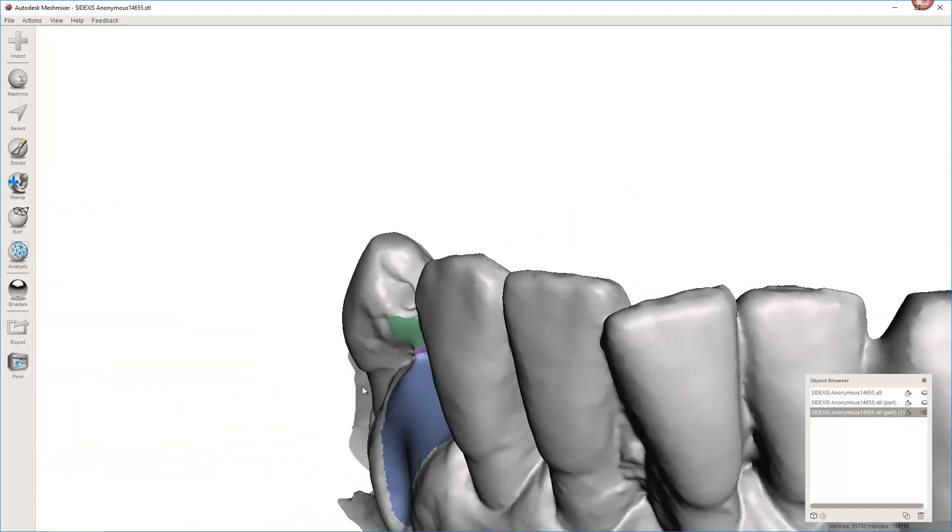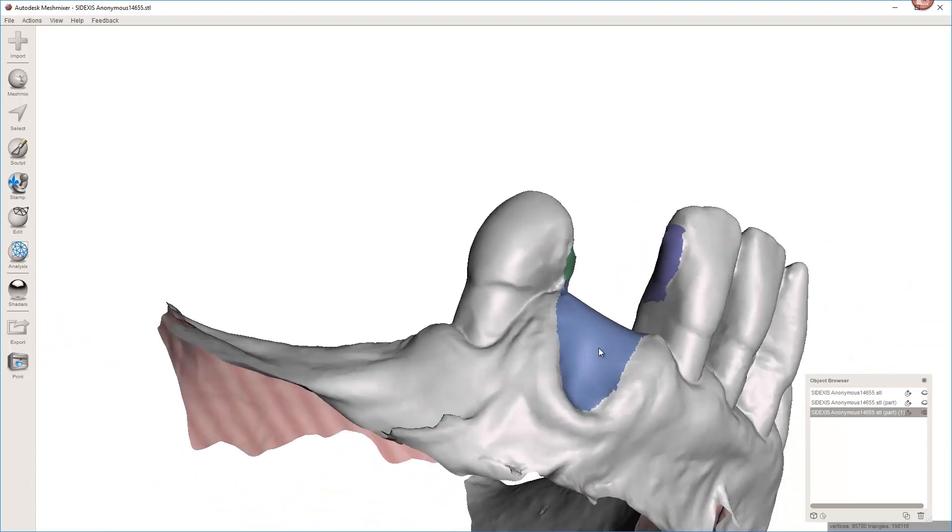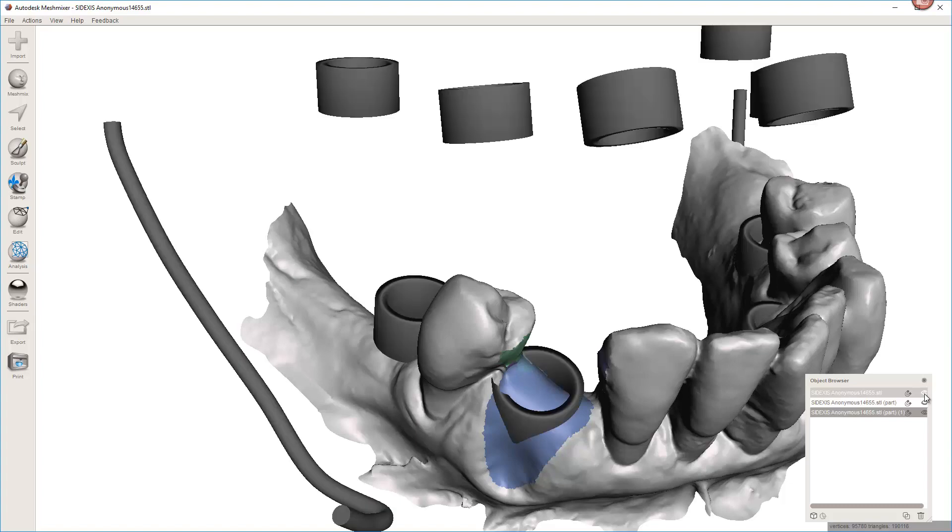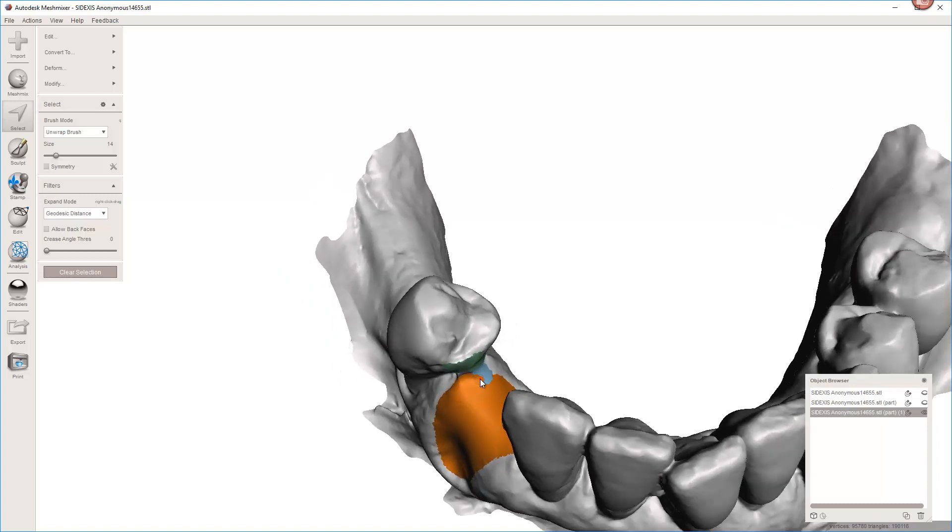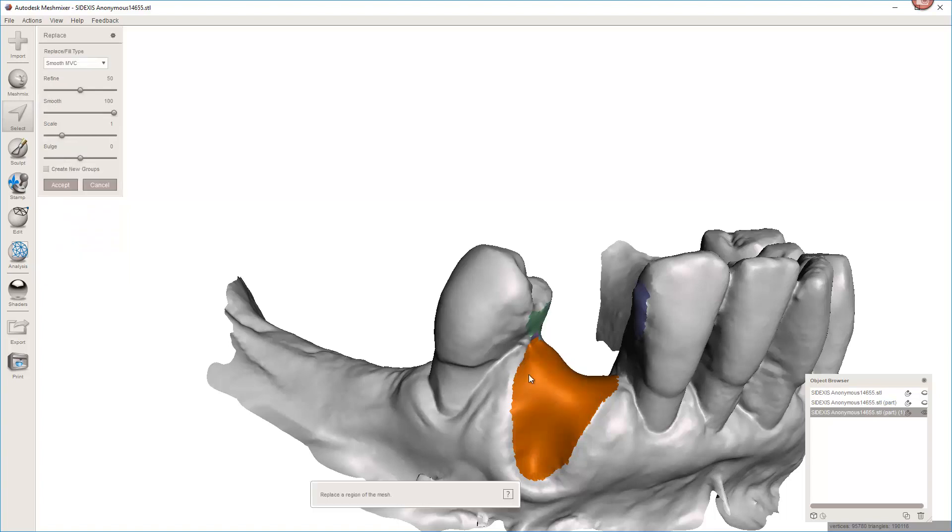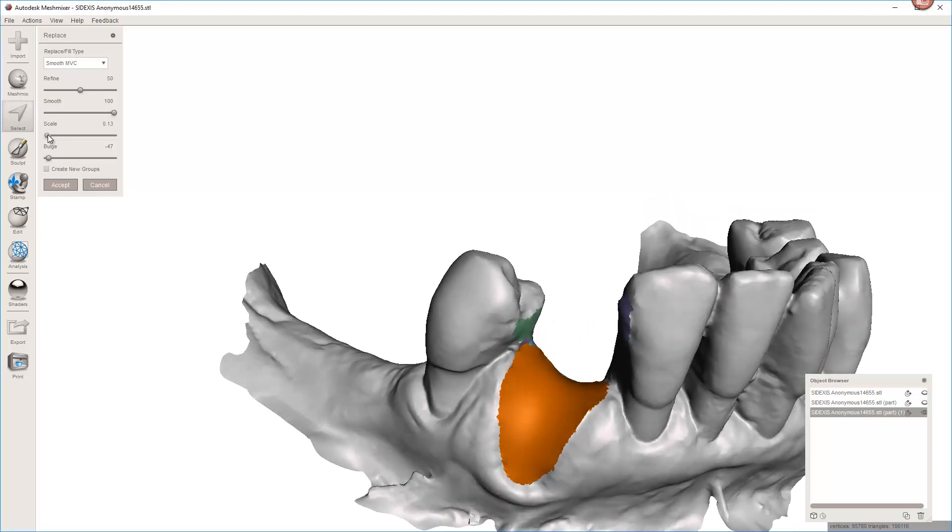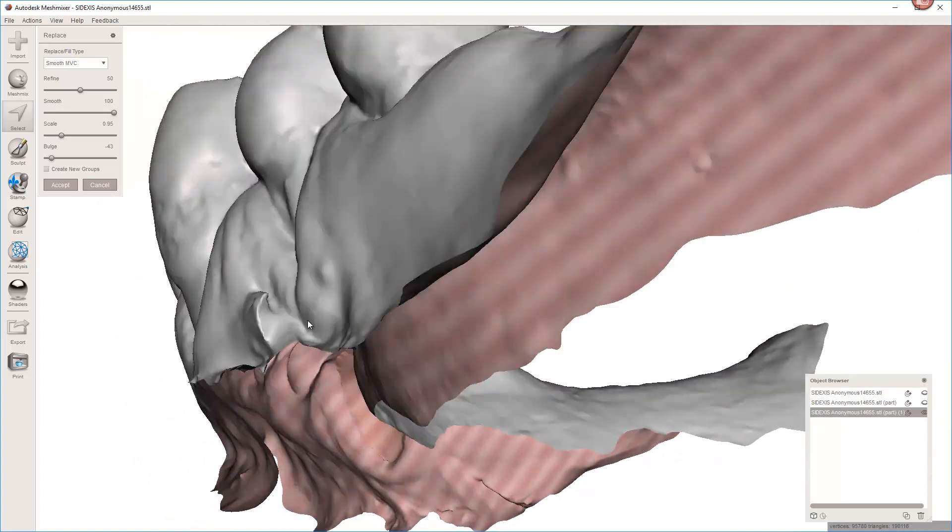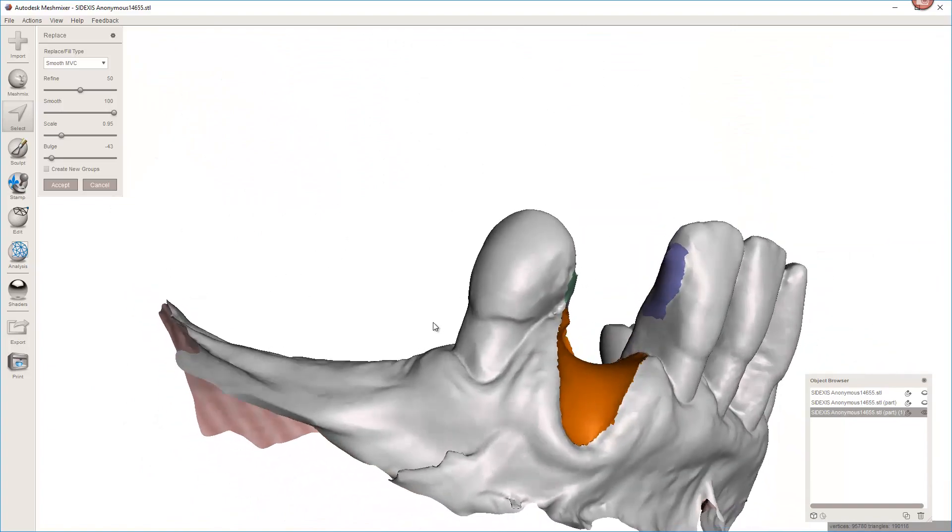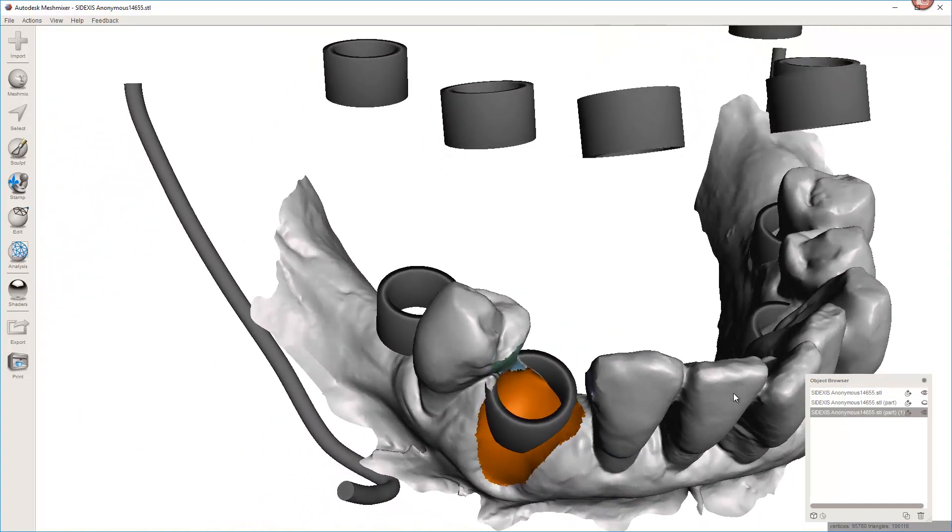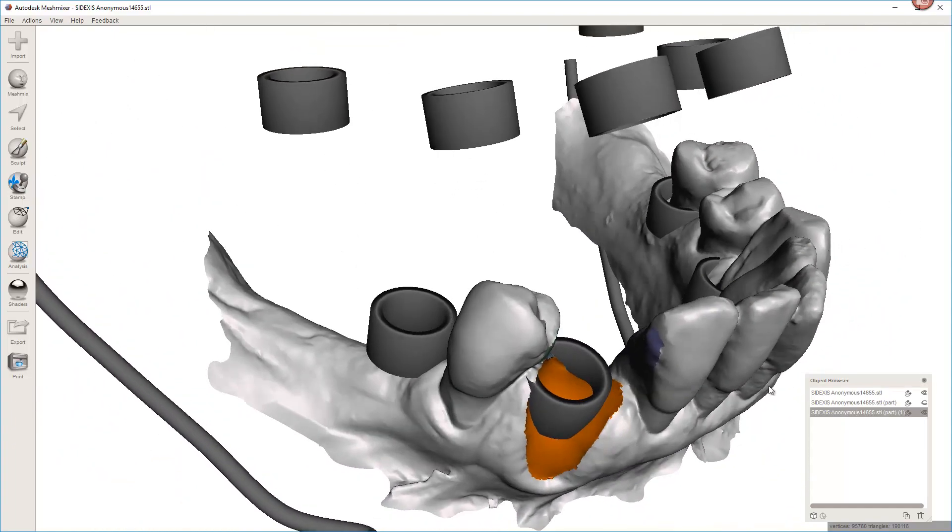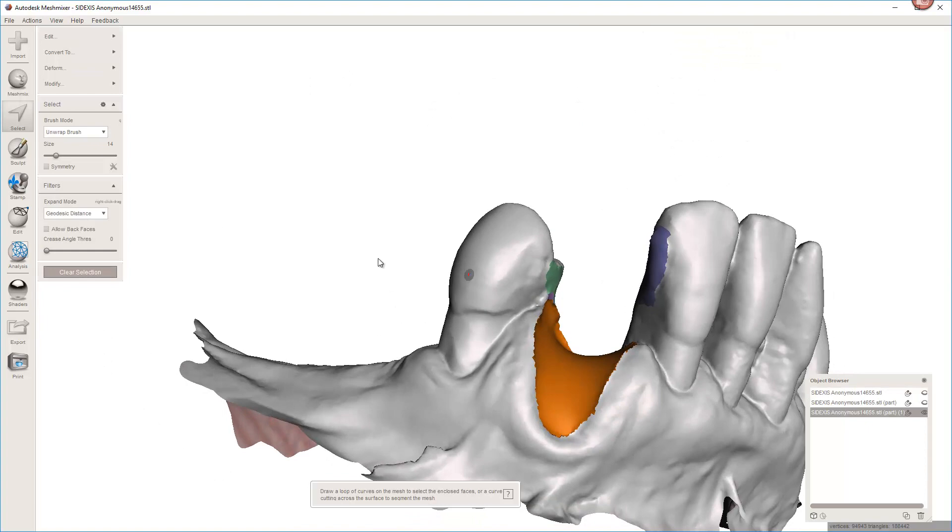And lastly I want to make this more concave so I can actually see my guide tubes. And I'm just going to go ahead and select. I'm going to double click here. I'm going to connect the dots right there. And now I can use that erase and fill button. Hit the F button. And I can scale this back a ways. So now we can change these a little bit to however we want. I'll end up moving this implant a little bit according to this. But I'm going to hit enter.